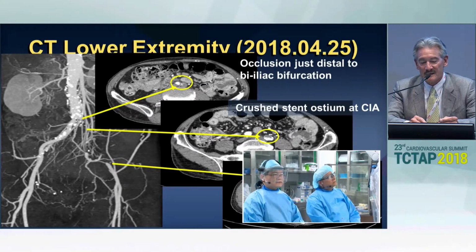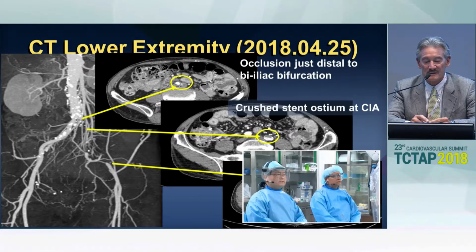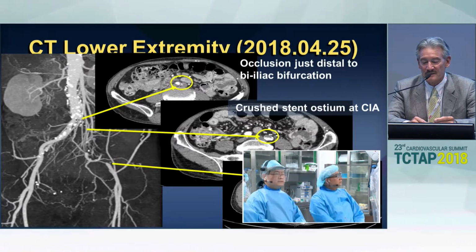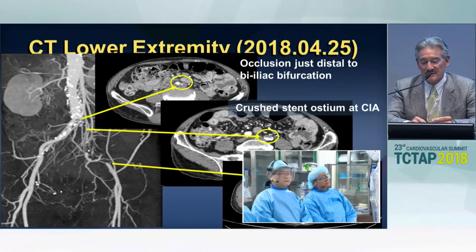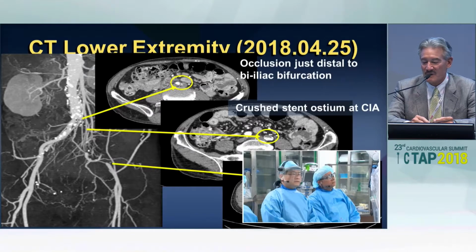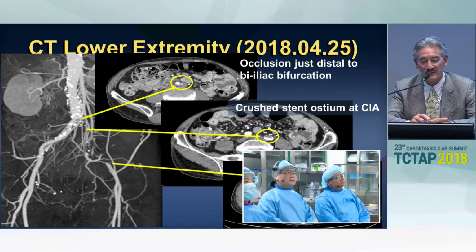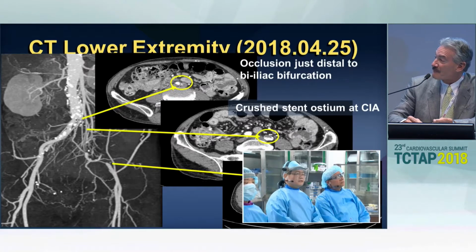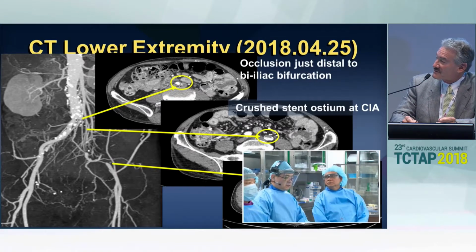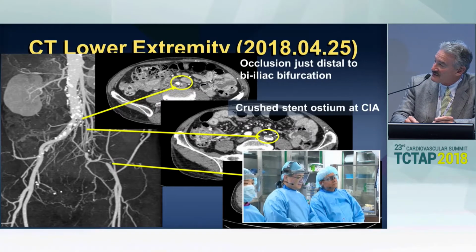That being said, now you're dealing with a much longer occlusion segment, an ISR Tosaka C occlusion. So the strategy, from my standpoint, is to recanalize and then probably apply a covered stent with higher radial force. That would be my approach anyway. Other panelists, before he moves on to his intervention, other comments?